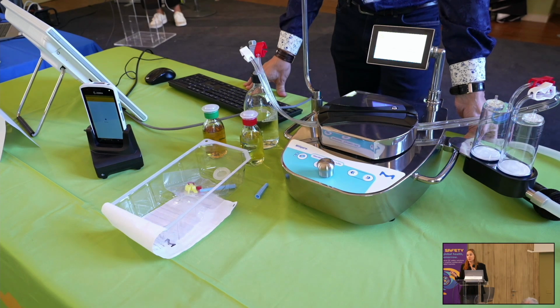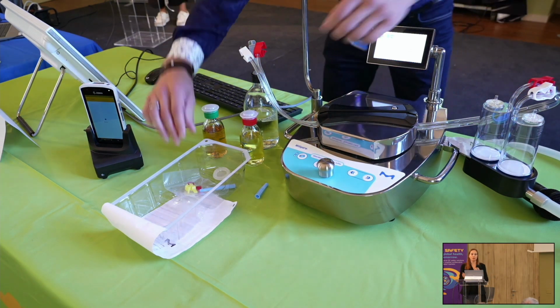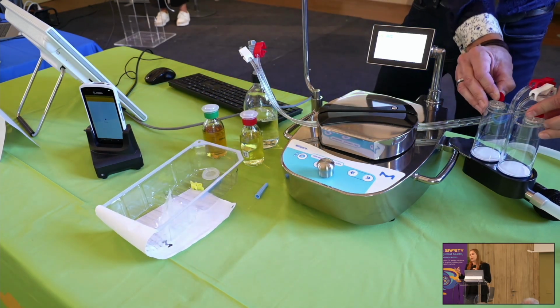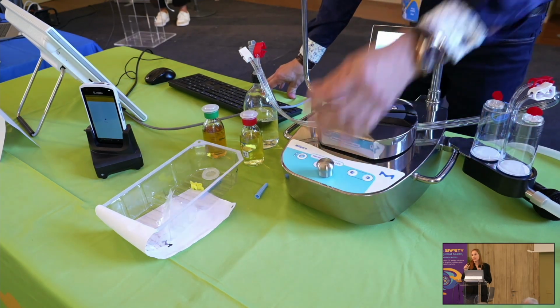Moreover, the pressure of the canisters is continuously monitored. So we will see the pressure values in the final report. And in case we have had an overpressure, we will detect it.